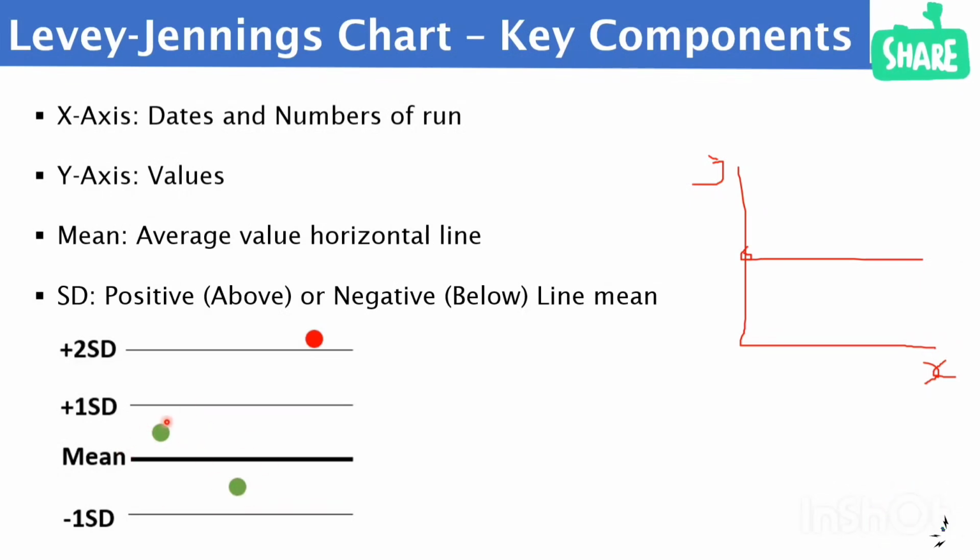While we have run this test, at this point we can say that the quality control has passed. At this point it has also passed, but here look, it's red. Why? This is the mean, which is what we expect, but due to the variation, which I will show as we progress, sometimes it can go up and down.